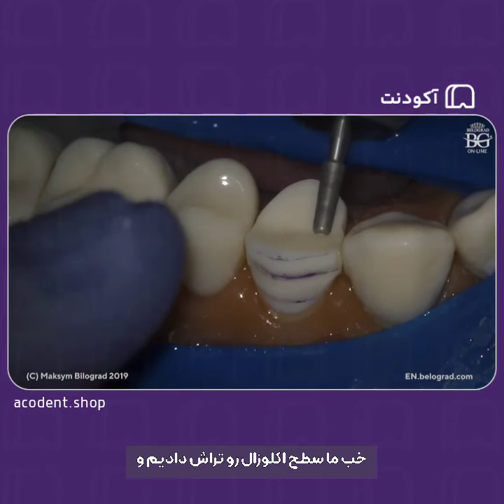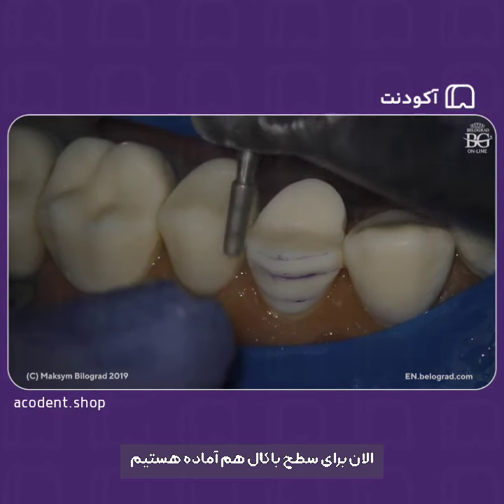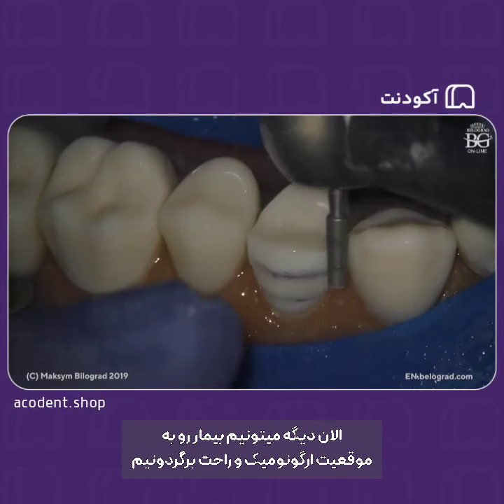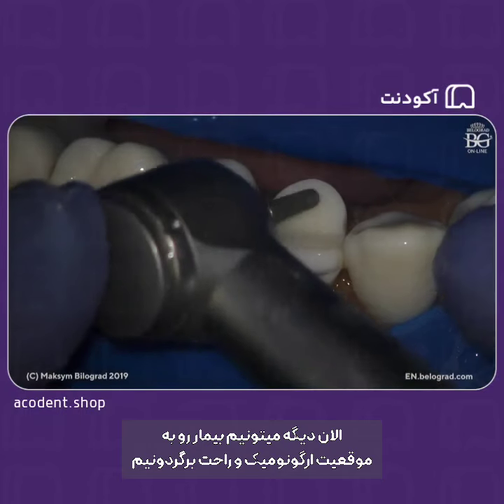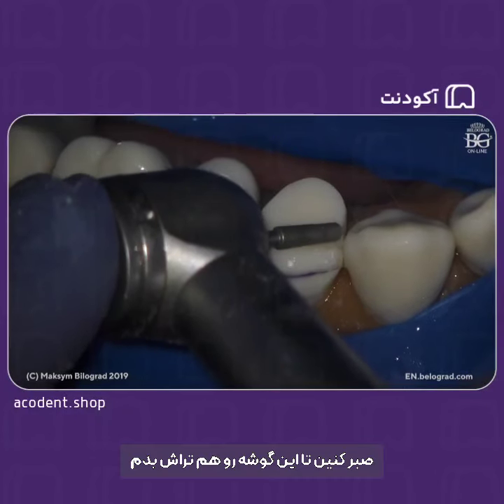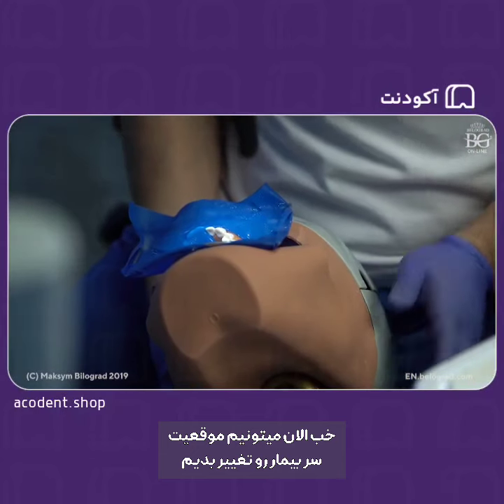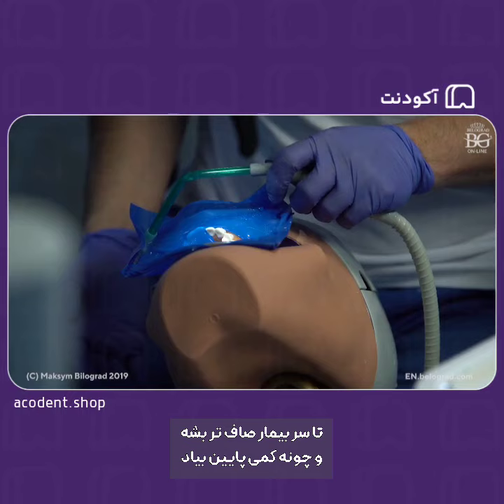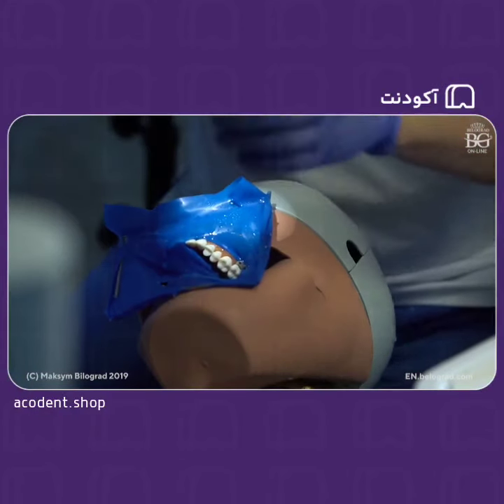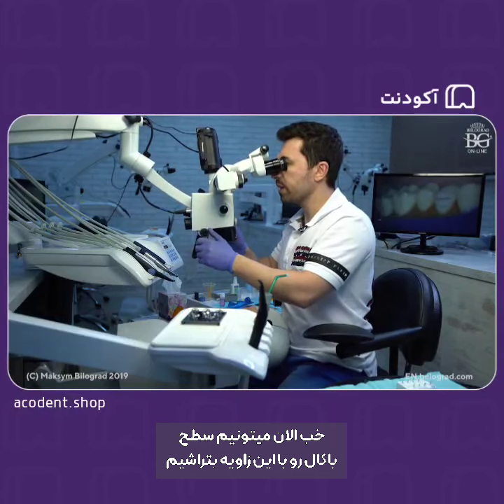Okay, so now we have prepped the occlusal surface and we're actually ready for the buccal surface, and we can finally turn back the head of our patient to a more ergonomic and comfortable position for the patient. But just let me take this corner out. Yeah, now we can change the position of the head of the patient to make it more straight, chin slightly down. Okay, so we will be able to prep the buccal surface with this angle.